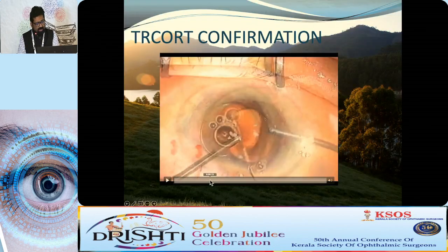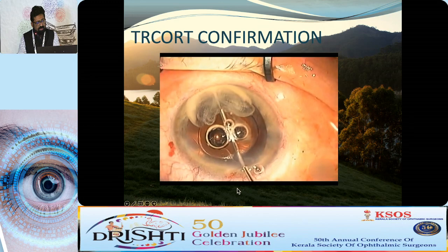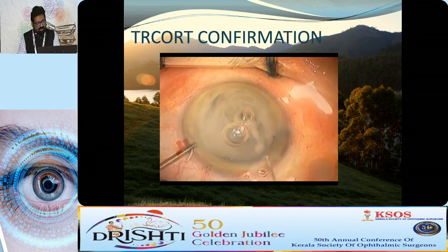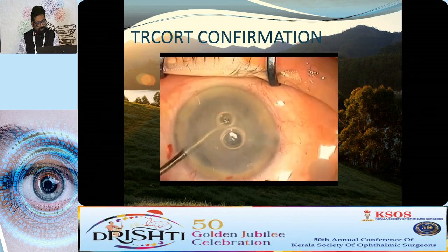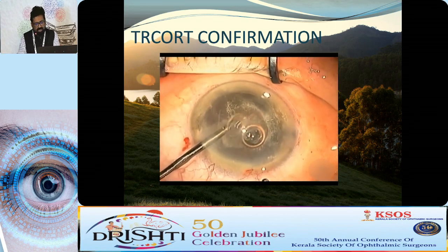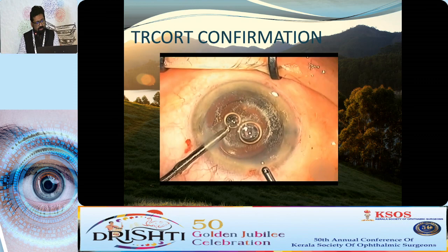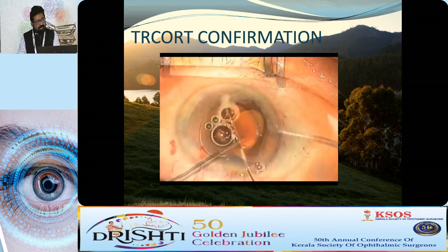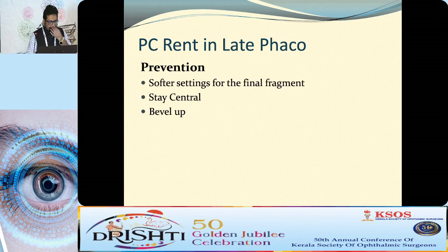And in this case, after implanting the IOL, just make sure that all the cortex is removed. You can be a little more luxurious in using aspiration after putting the IOL, because nothing much will go into the posterior segment now. Yeah. So to prevent it, go for softer settings for the final, stay central and bevel up.